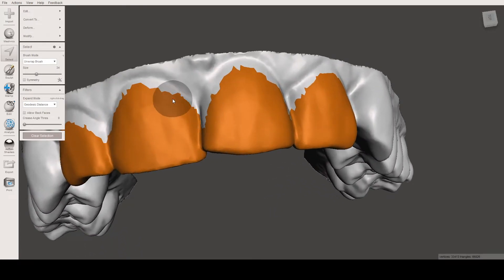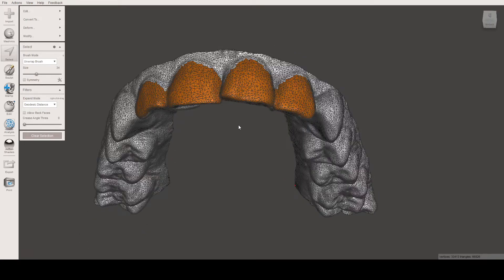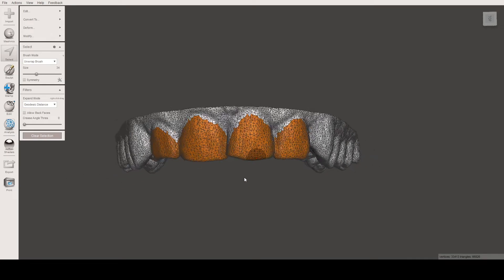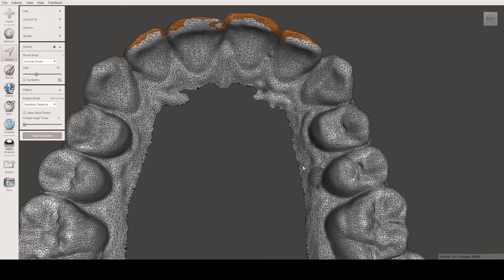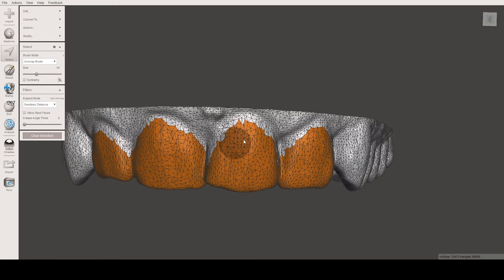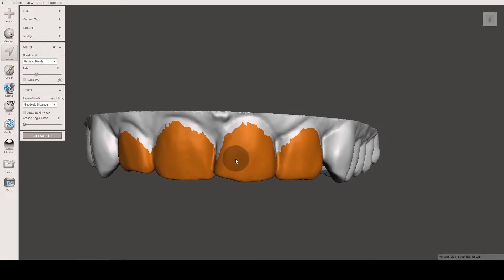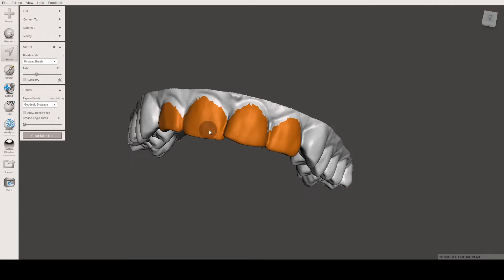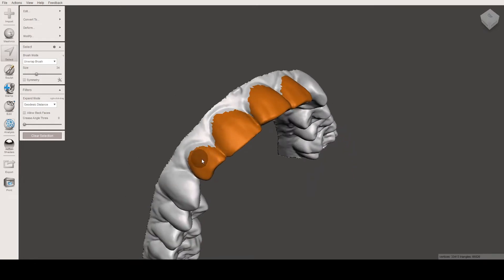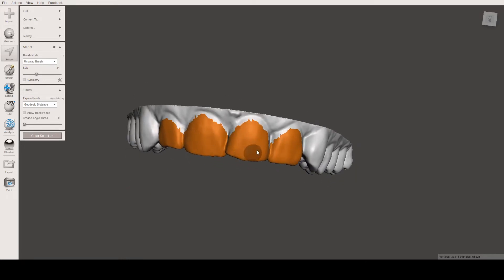The edges are not very smooth, and the reason for this is that if we press W, we can see the triangles that form the 3D model. STL files like this one are made of these tiny triangles, so we are basically selecting the triangles. We press W again to return to normal mode. I will show you the best way to smooth these borders — it will actually be very smooth.